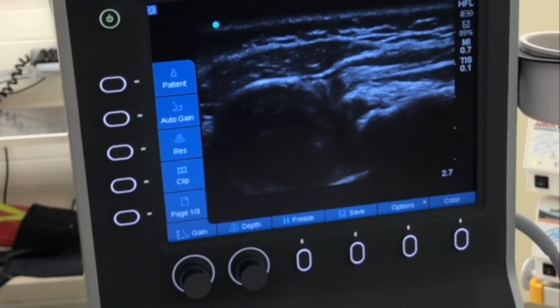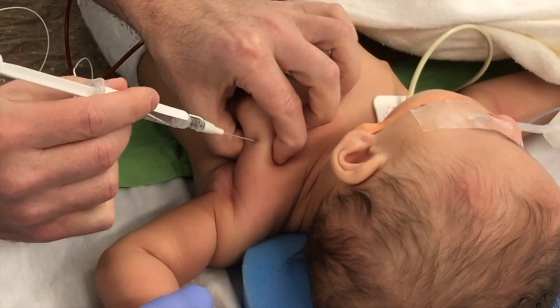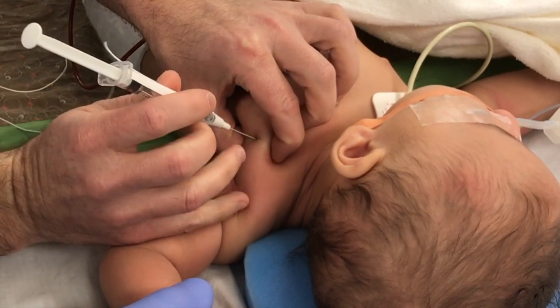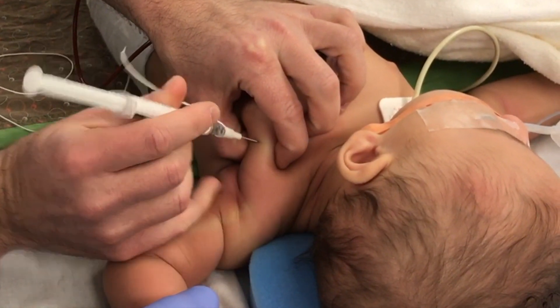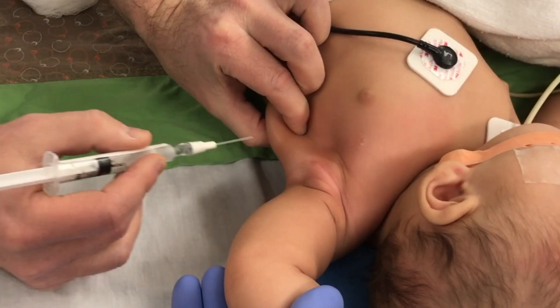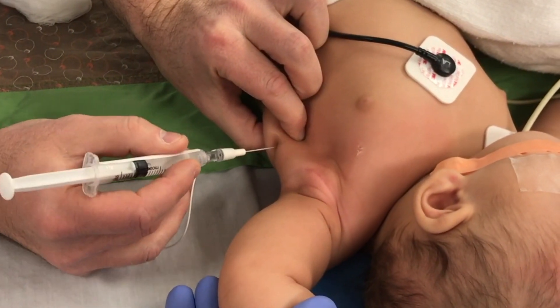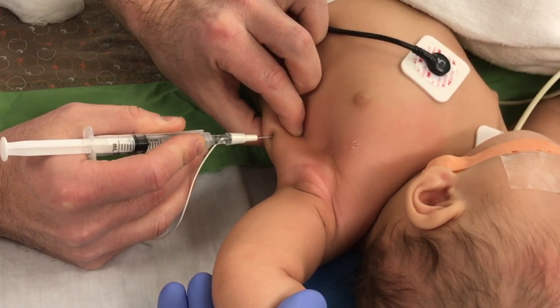Because a joint reduction can be effected closed, Botox and casting is then performed, beginning with the pectoralis major. Electrical stimulation is used to confirm needle placement prior to injection. Next, the teres major and latissimus dorsi are injected. We typically inject 100 units of Dysport per muscle.